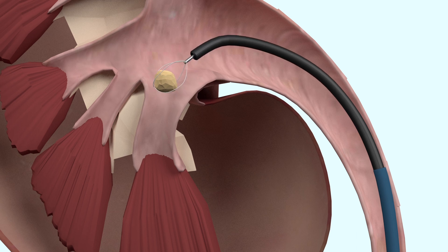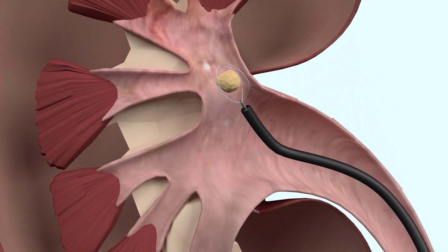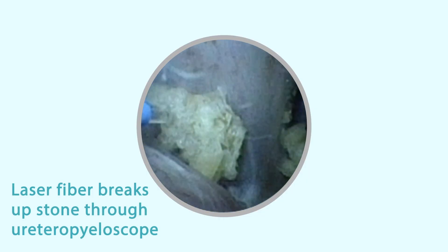This particular stone is located in the lower pole of the kidney and needs to be repositioned into the upper pole using a fine basket. A very fine laser fibre is then deployed from the end of the scope and the stone is fragmented into small stone-like pieces.